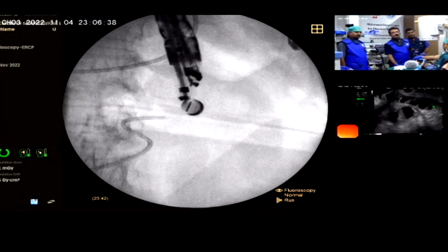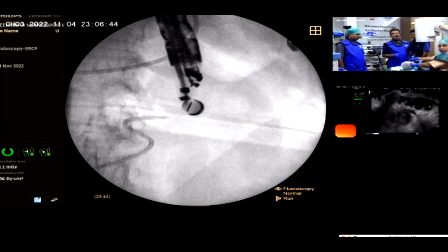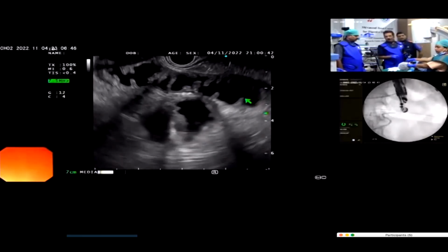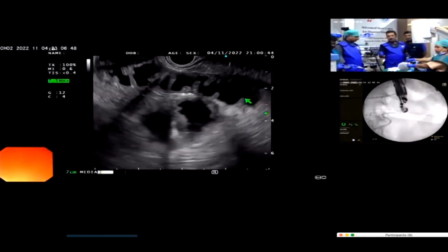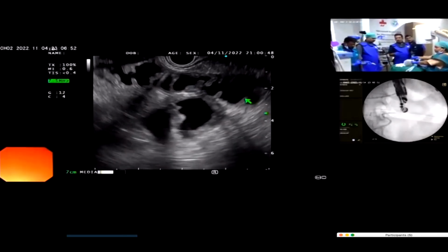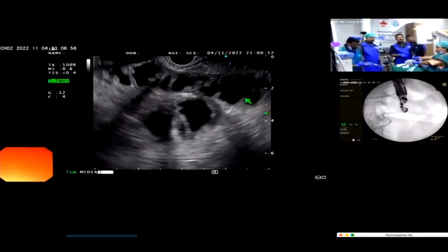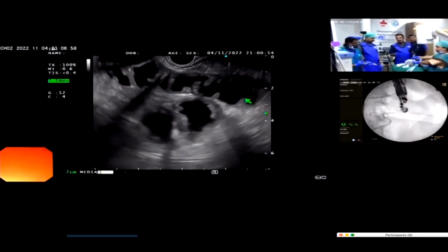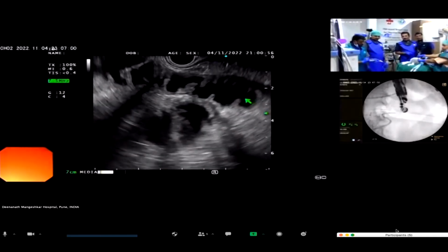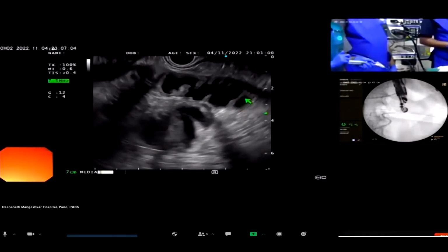And what you can see is the paralyzed duodenal loop, the DJ flexure loop over here. And we have filled it up with saline, stained with methylene blue. And Rahul is filling up. So he's put in about 250 ml so far, and he's putting about 50 ml more. And we'll put in also some contrast to just check that. So Rahul, what are you putting just now? Contrast or saline? Okay. So after this, put contrast also.